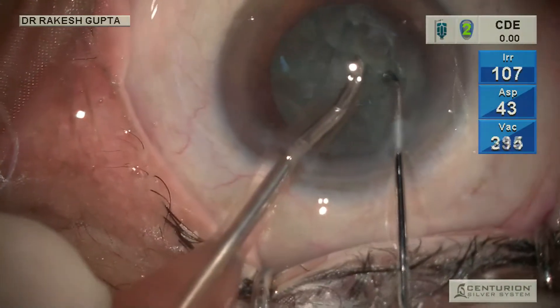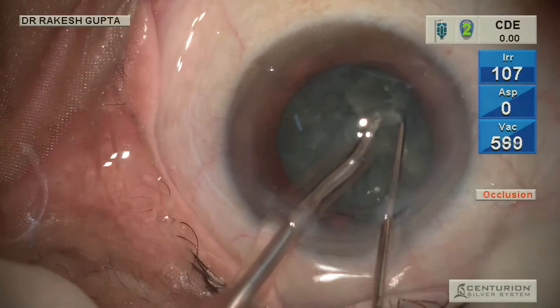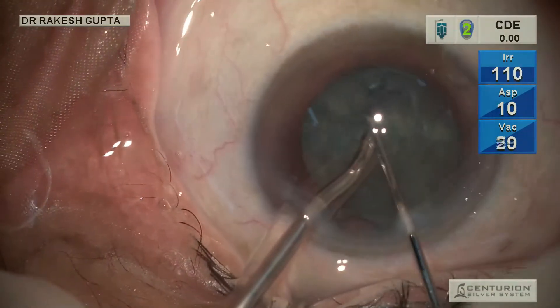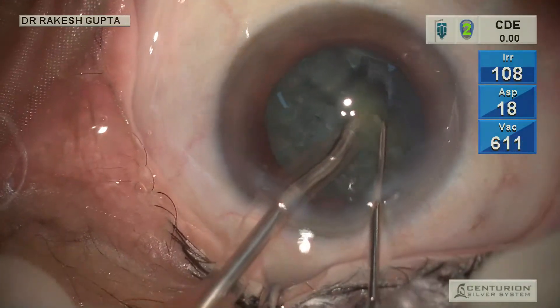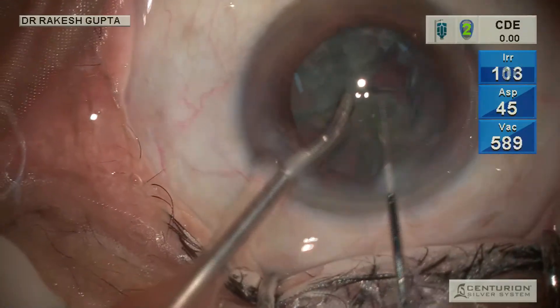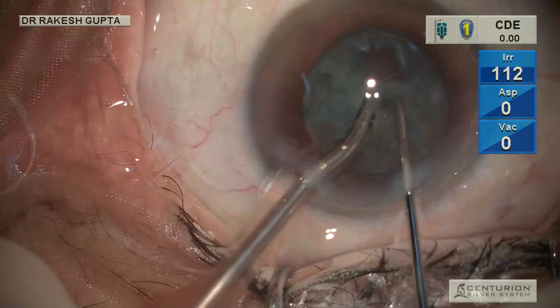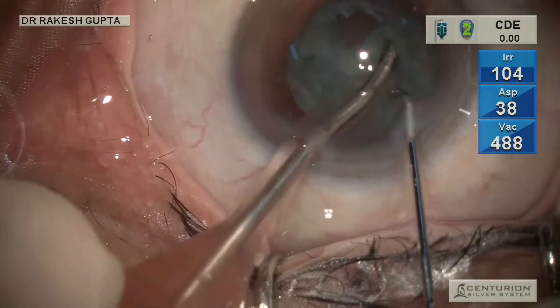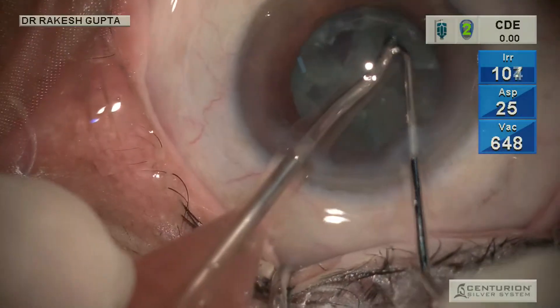This is the first video I am sharing where I am doing surgery with the left hand. I developed ambidexterity during COVID time by practicing with my left hand, and that has also helped me in improving the maneuverability of both hands. You can see this is surgery where I am using the left hand as the dominant hand and using the second instrument with the right hand.